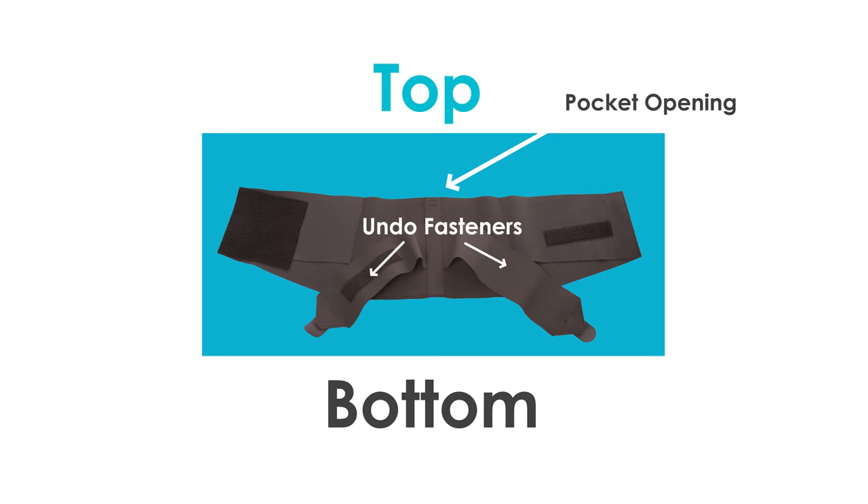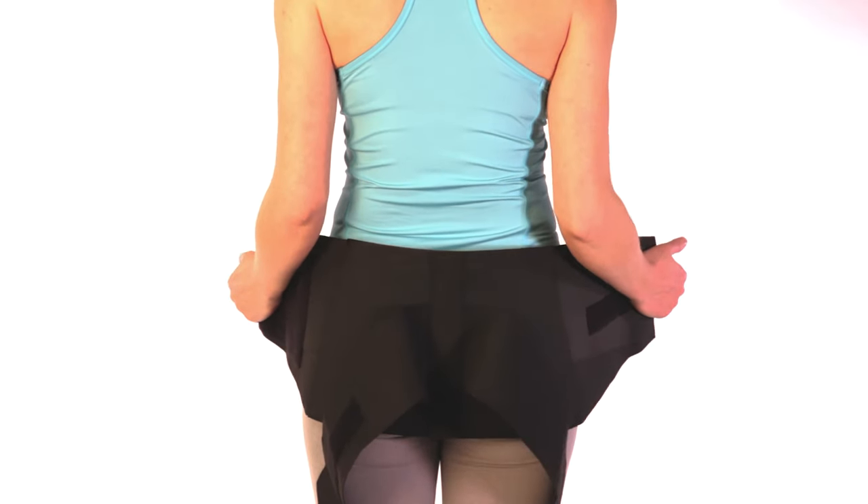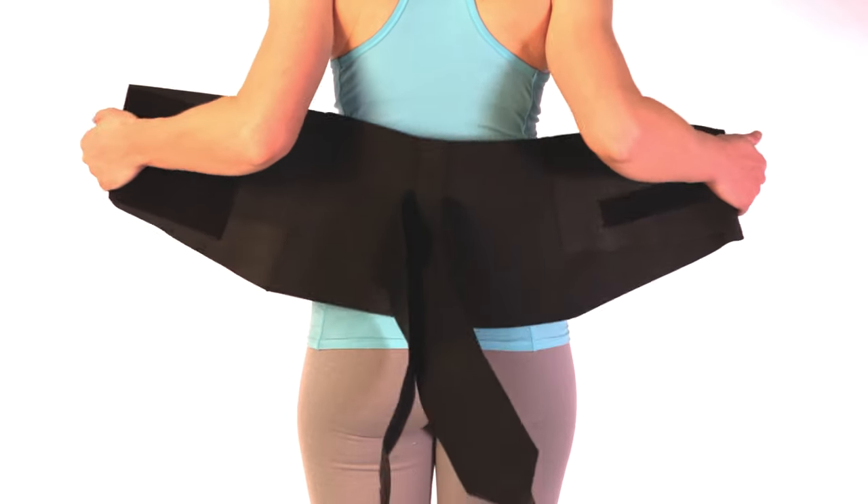Gel pack or foam pressure pad must be purchased separately. To apply: unhook all closures and lay the brace flat on the floor to identify the topside. Position the brace behind your body so it's centered on your back, with the bottom of the brace sitting at the widest part of your hips.